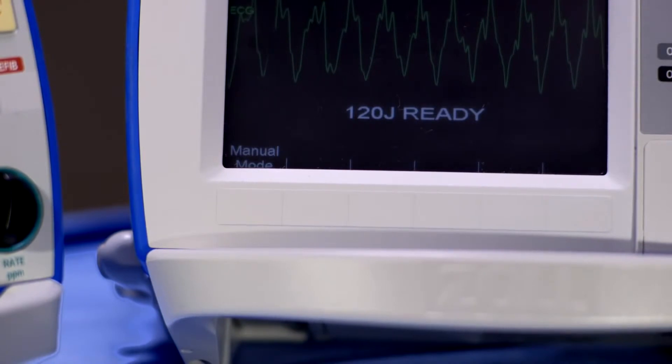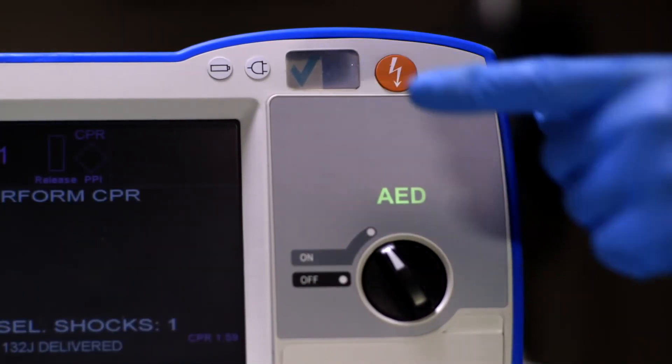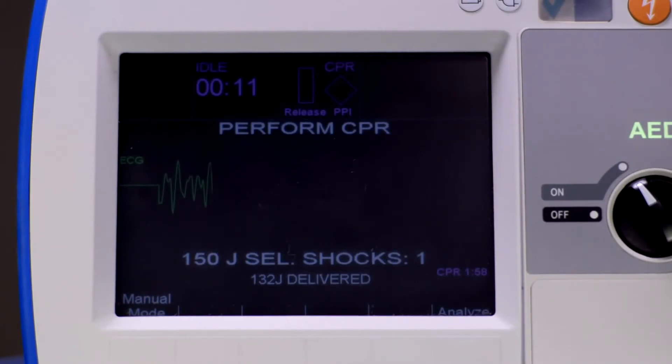The defibrillator will analyze the patient's rhythm. If a shockable rhythm is detected, the device will charge itself and instruct you to press shock. Before shocking the patient, ensure the environment is safe for defibrillation.